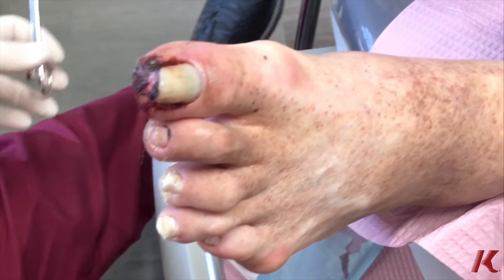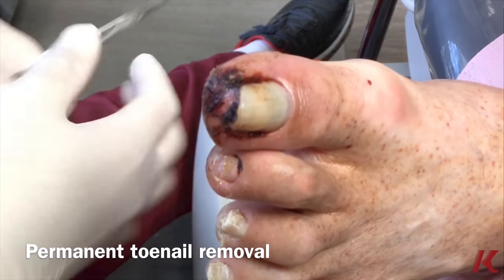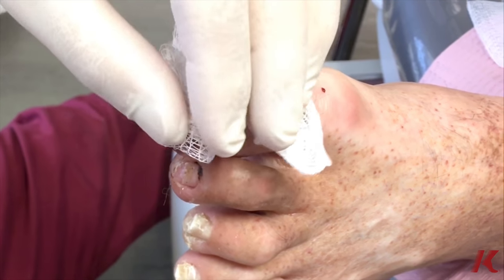I just went ahead and numbed him up, and now we're going to remove the entire toenail once he's numbed up. We just make sure he's fully numb and he has no pain.